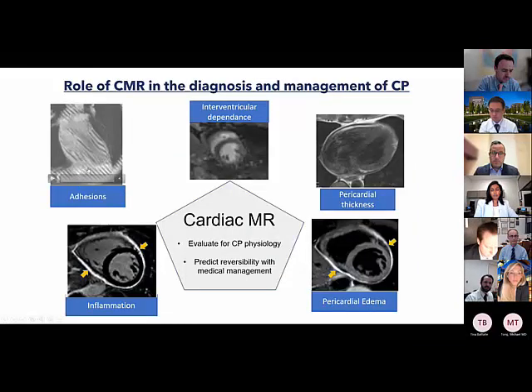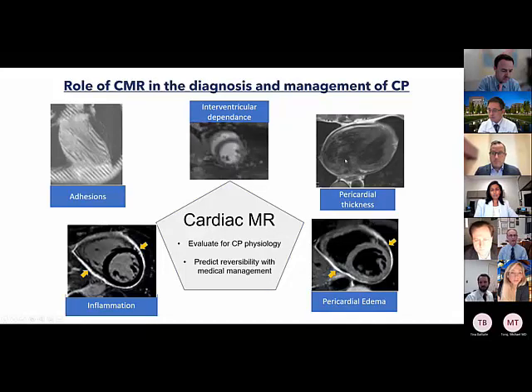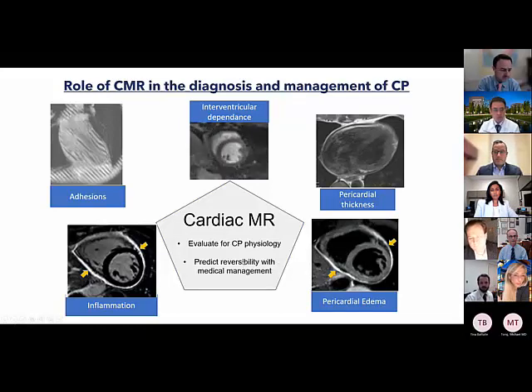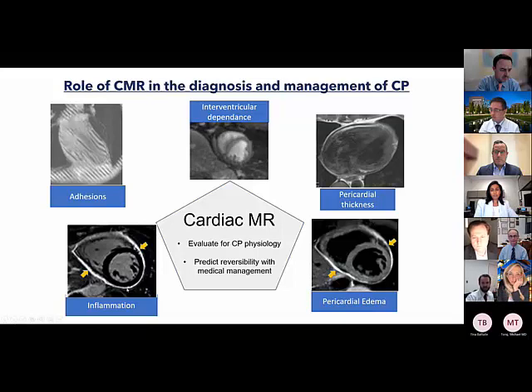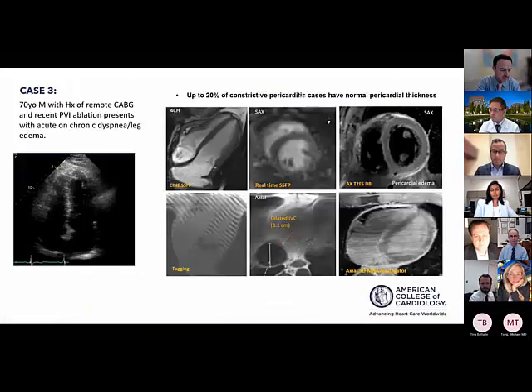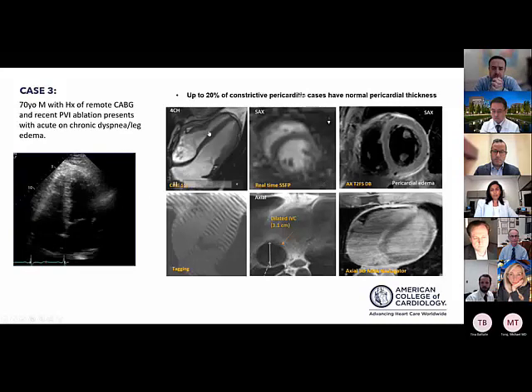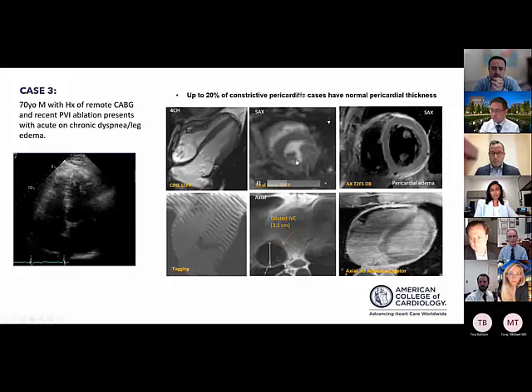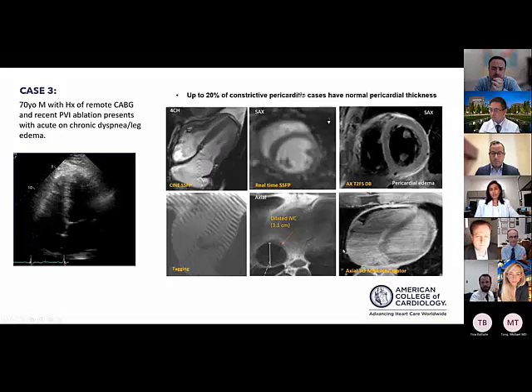MRI features in constrictive pericarditis include adhesions on tagging imaging, ventricular interdependence on free-breathing sequences, increased pericardial thickness visible as a black line between pericardial fat layers, and assessment for inflammation. In Case 3, confirmation of constriction is made based on tubular deformation of the ventricles, respirophasic shifts, and critically, evidence of edema and inflammation on MRI — which significantly changes management.